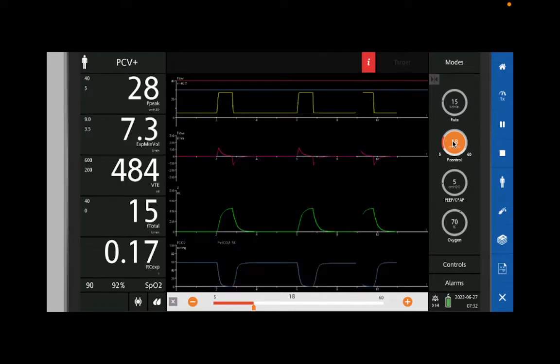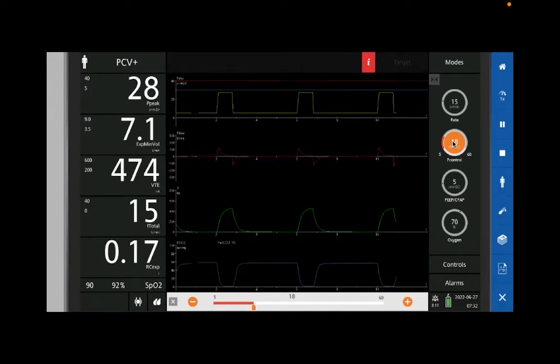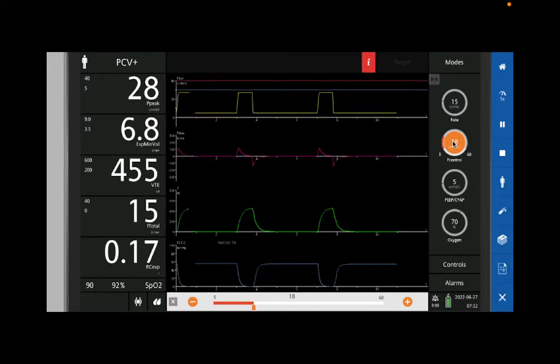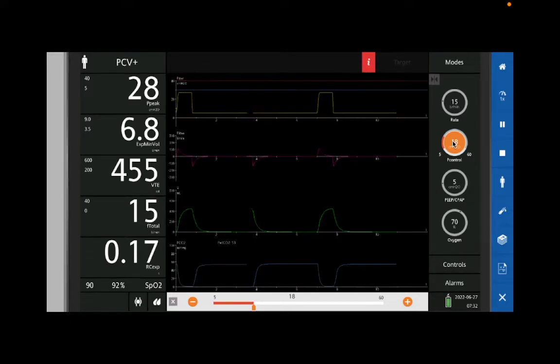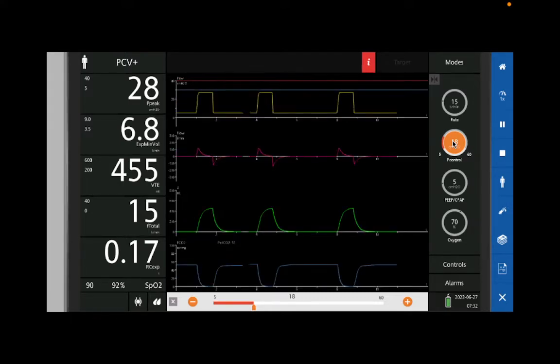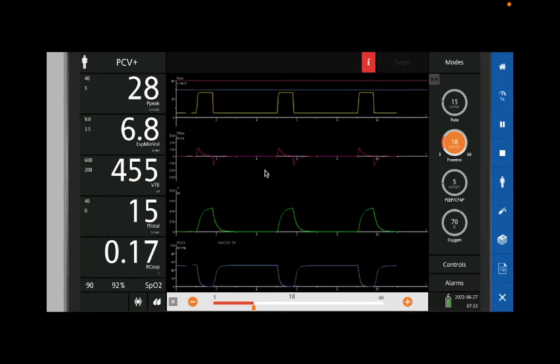Who thinks this full-time job is really stupid? Yes? All we are doing is adjusting the pressure breath by breath, right? We see what the last volume was, and we're going to increase the pressure up or down to try to get the volume. And so we could go to our consultant, why not go to volume control, right? If you're so picky, and your consultant says, I want to be able to keep that volume of 360, but pressure control is more comfortable for the patient. They get a decelerating flow waveform, and they're more comfortable. So keep it at 360.